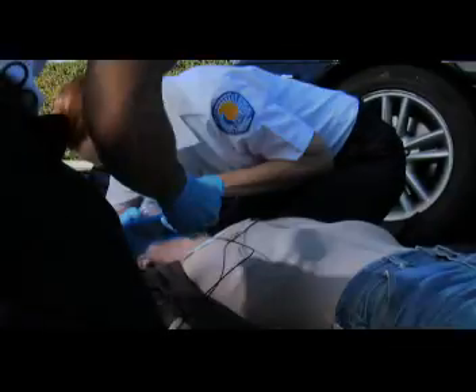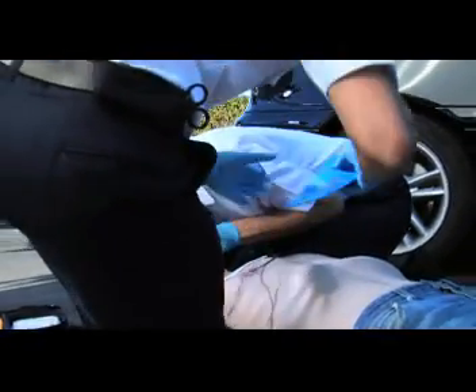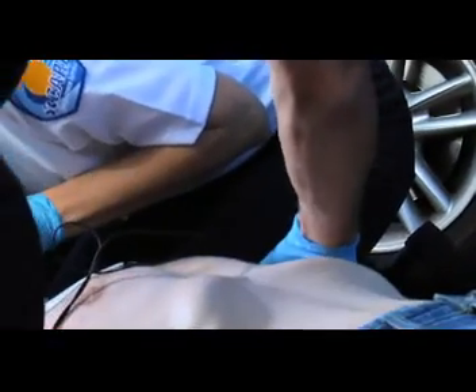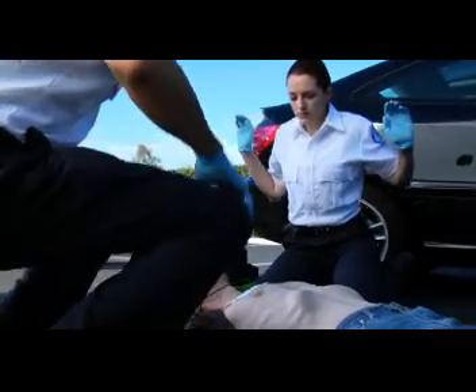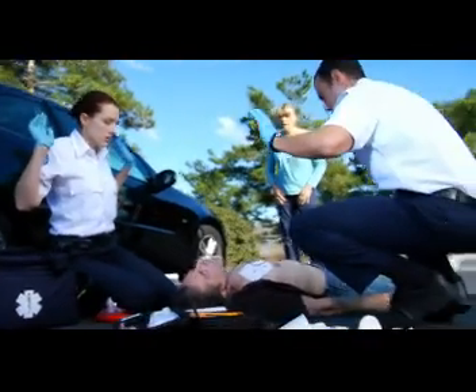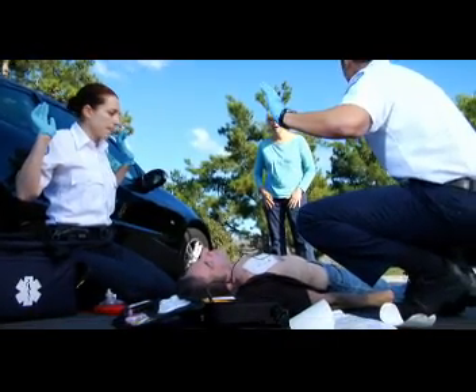Apply defibrillation pads. Connect cable. Analyzing heart rhythm. Do not touch the patient. I'm clear. You're clear. We're all clear. Shocking.